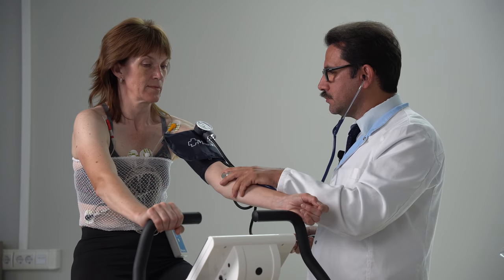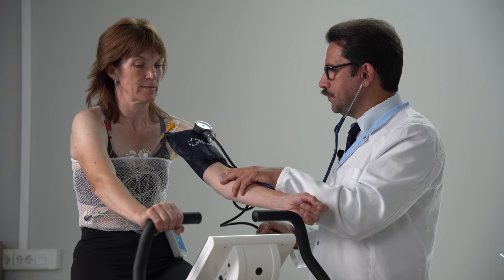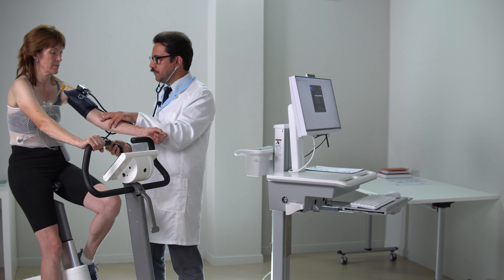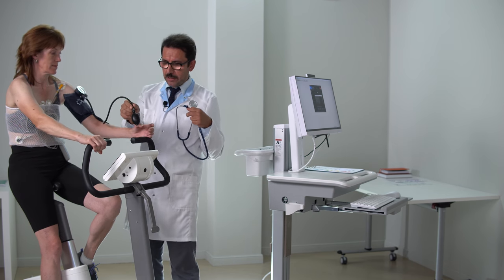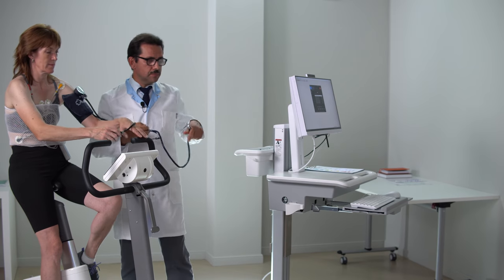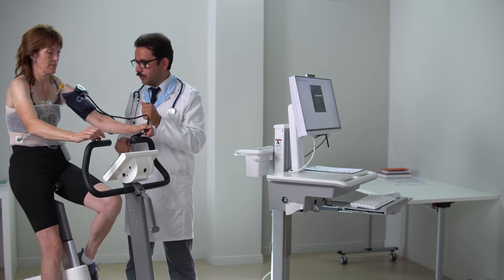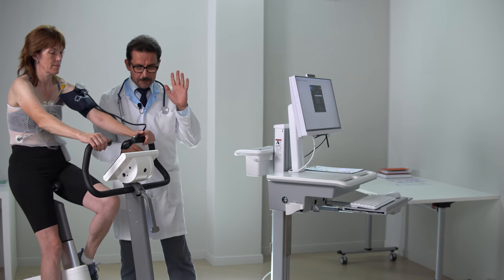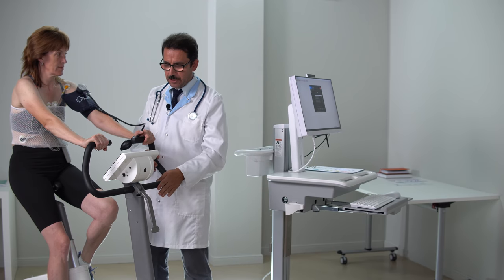Okay. We need to have baseline parameters. And again, I'm measuring blood pressure on the bike sitting. So to have these baseline characteristics like ECG from the current setting. Okay, now we're set. We have blood pressure, we have ECG, we have instruction for the patient.